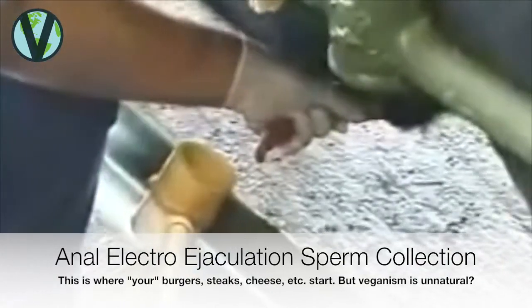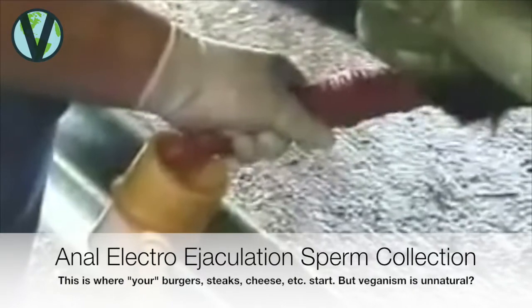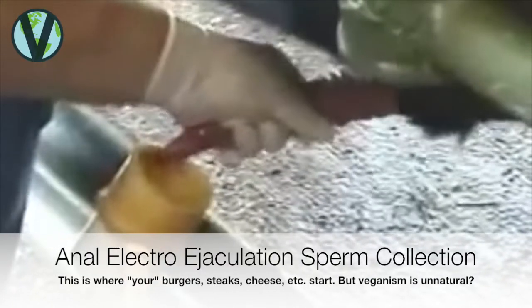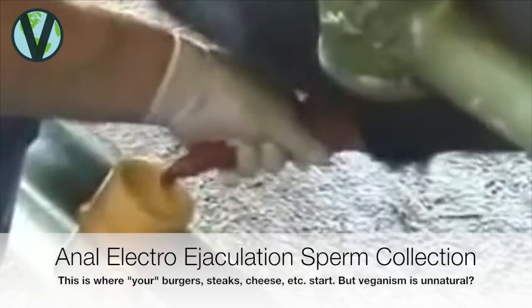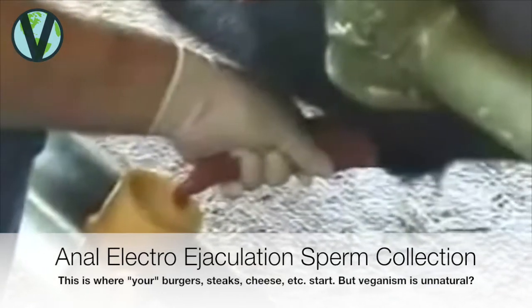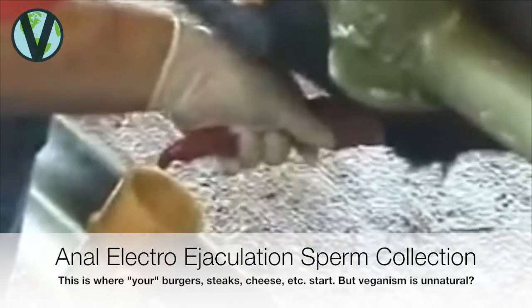Here you can see some of the clear fluid coming out during the collection, and we'll keep repeating this process 5 to 10 times in order to get a nice collection from this bull. So here you can see a stimulation for contraction and relaxation, stimulation, and then the current is turned down.